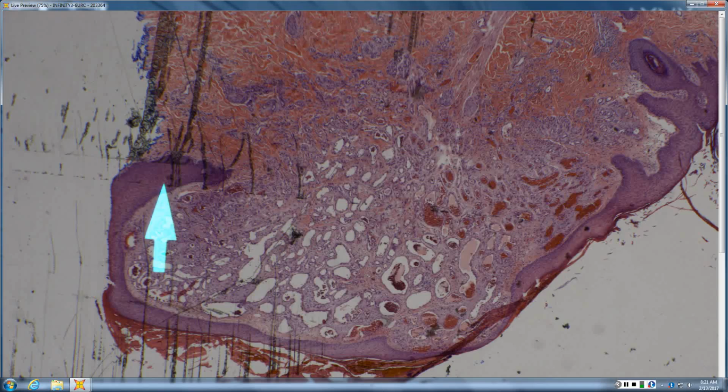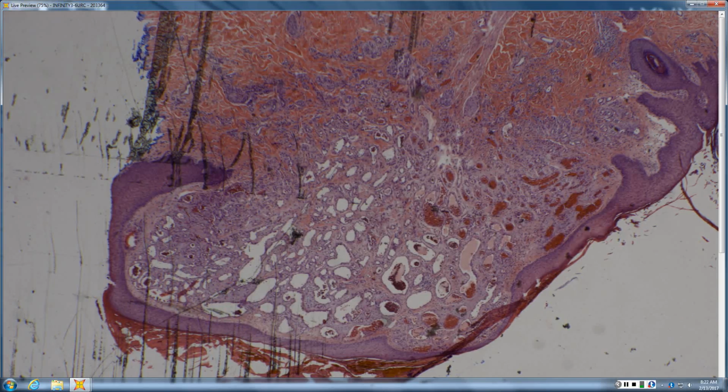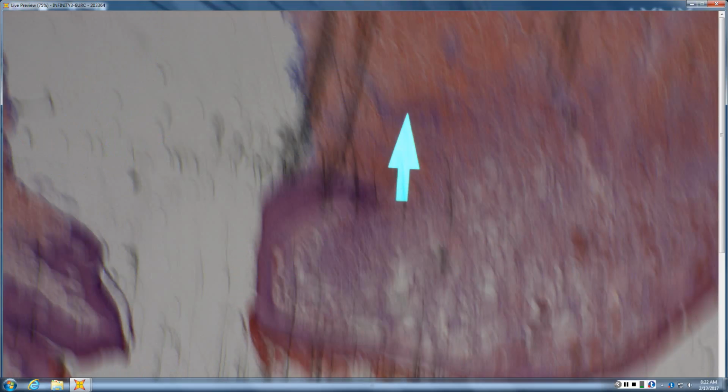Maybe neither of those. Maybe like a PG. Yeah, collarette suggests it was maybe eruptive, maybe an older PG. There's some suggestion of fibrous septa, like it was a lobular proliferation. PGs always have a feeding little arteriole, so essentially they're fancy arteriovenous malformations that are distinctly lobular, eruptive, and start as packed endothelial cells, and then with time they age and become more ectatic.